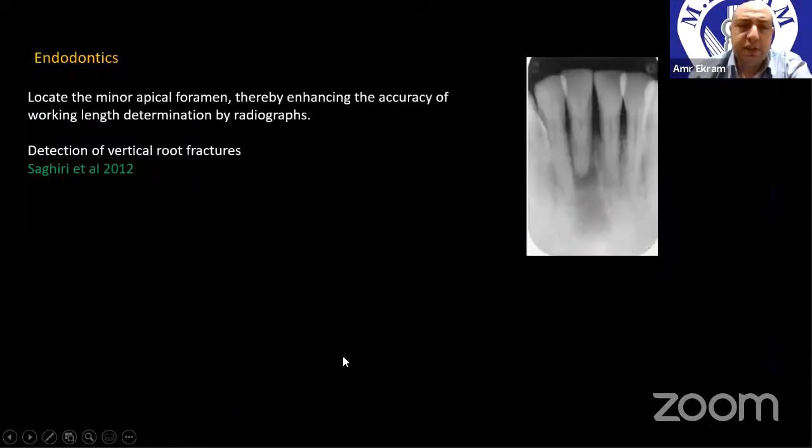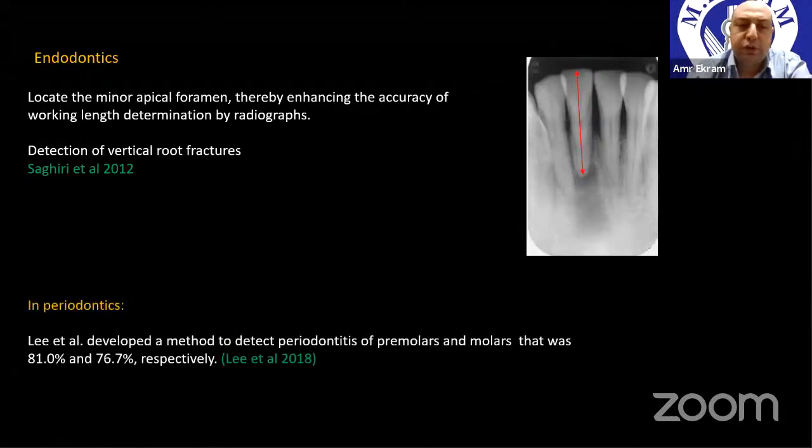In endodontics, for detecting the working length, or vertical root fractures, if obvious, and also in identifying periodontal disease.